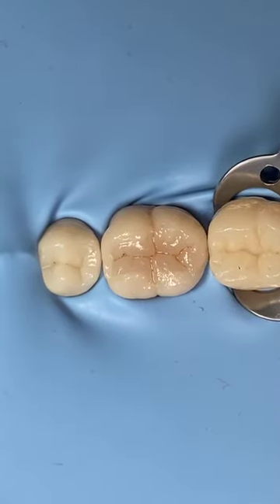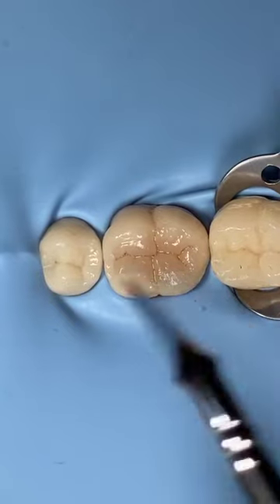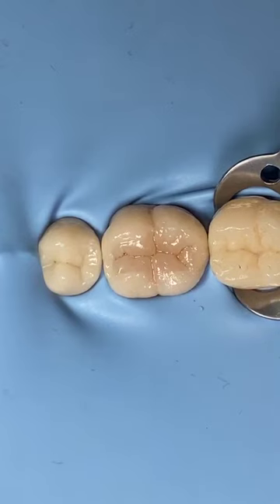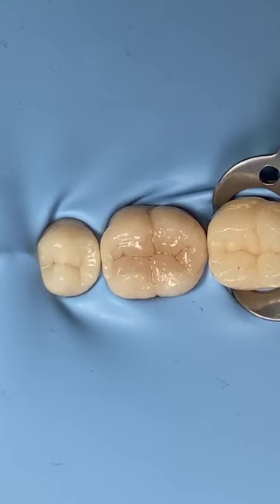Maybe some of you have a question: if you already did polishing, there will be dust there. If you do it my way here, so I do polishing first and then put the stain, how to remove the dust? You can easily use a microbrush. Dip it in water and then just rub it with your microbrush, or if you have sandblast or AquaCare or something like that, you can use only the water. Or you can use only the air. Just blow with the air.